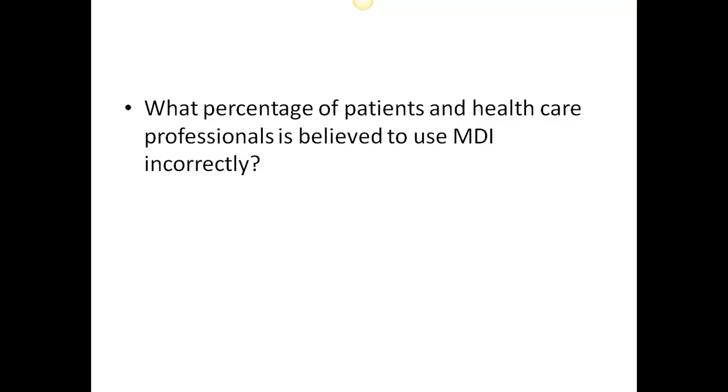The most important thing, however, is for us to give patients an adequate explanation and education on the device the first time it's used, because of that saying, old habits are hard to get rid of. Once we learn something one way, it's really hard to change the way we use an MDI if we are using it incorrectly.